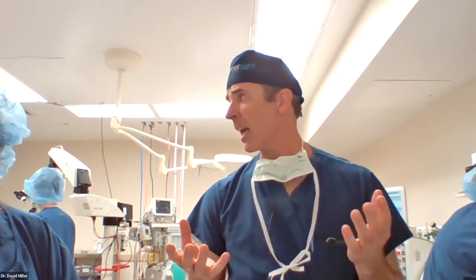And any consequences from iatrogenic hemorrhages caused by instruments near the macula? Really none. If you get a hemorrhage on the macular surface, it's almost always gone the next day. Hemorrhages in the deeper layers at the RPE or deep retina may make an RPE defect or atrophy. That's why you want to be away from the fovea. Ideally, all your hemorrhaging should be away from the fovea. This last case had a hemorrhage near the fovea. It could not be helped. The tissue was extremely adherent, very dense PVR over the macula there. But then you saw the fold in the macula. So if you don't get the fold out, we're kind of stuck anyhow. So just have to be more aggressive sometimes.